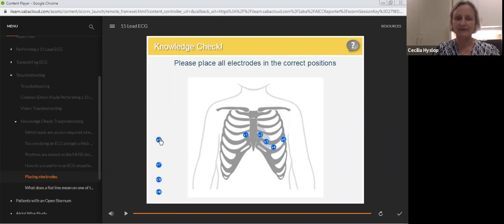And then we're going to put V5 in the middle, just for a standard ECG, and V7 is going to go in the posterior. Just put that again. Oh, it's got a mind of its own. There we go, so I'm going to put that around here. And this popped out of place, halfway in between. And then we're going to do V4R next.